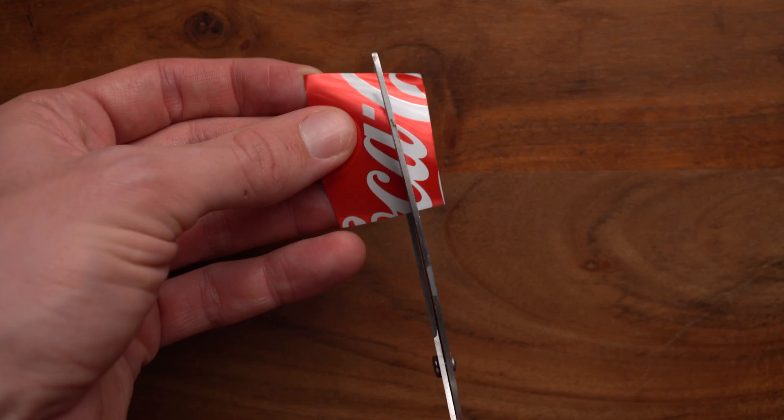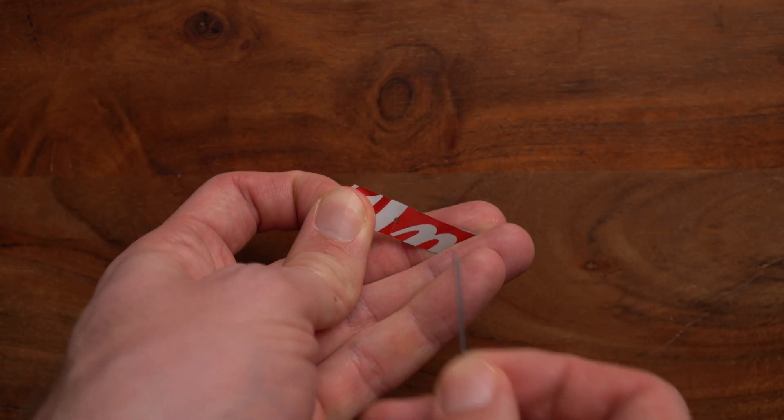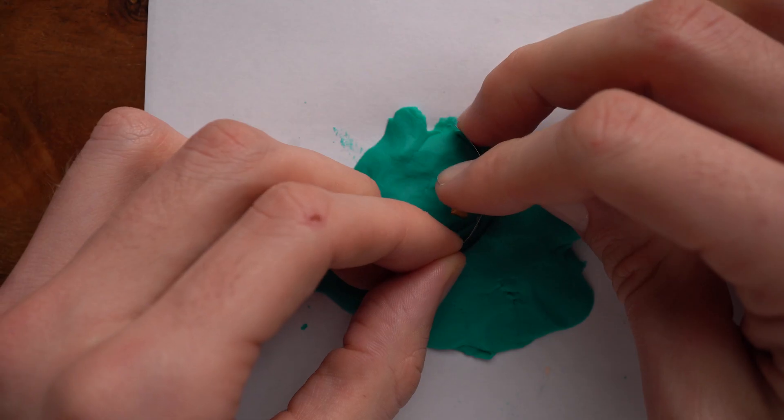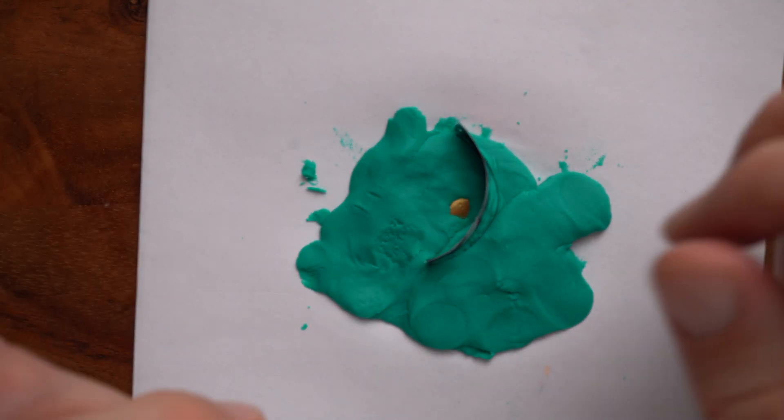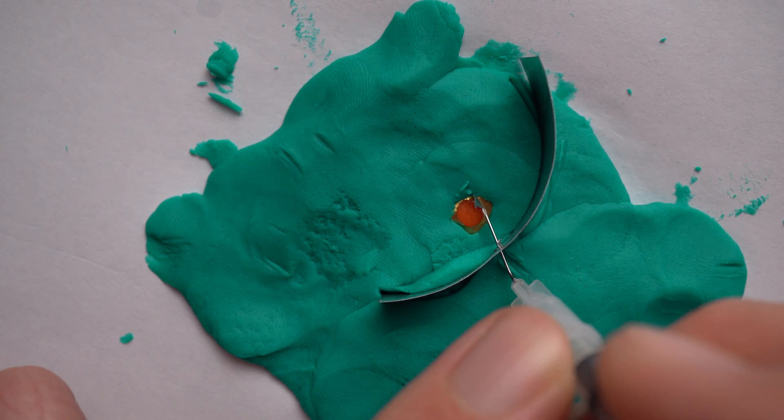Pretty cool, right? Now when you manage to do a continuous, centered, and round rexis every time, you can move up a level and practice your pivoting. For that, you need to use scissors to cut a strip out of your tin can. Then use the 18 gauge needle to poke a hole in it. Then you can stick that piece of tin can into the Play-Doh and start practicing your rexis while pivoting through that fake incision.